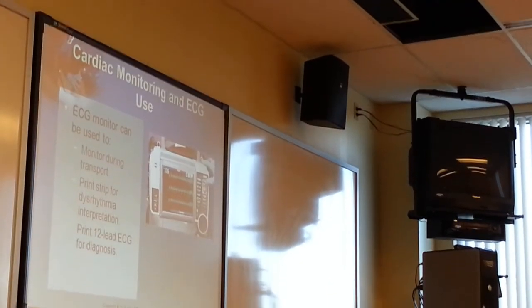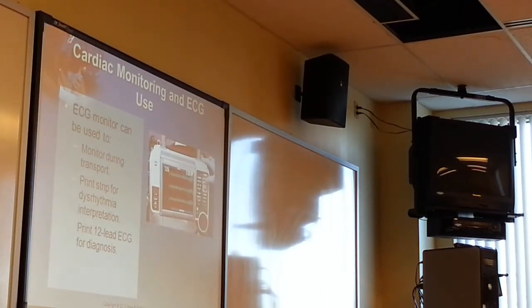So, the EKG monitor can be used to monitor them during transport. We want to print the dysrhythmia strip. We want to print the 12-lead EKG for diagnosis.